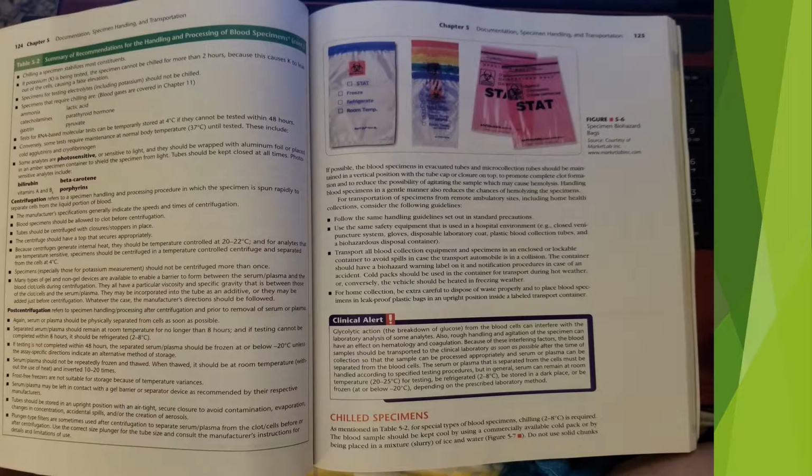If possible, the blood specimens in evacuated tubes and microcollection tubes should be maintained in a vertical position with the tube cap or closure on top to promote complete clot formation and to reduce the possibility of agitating the sample, which may cause hemolysis. Handling blood specimen in a gentle manner also reduces the chance of hemolyzing the specimens.